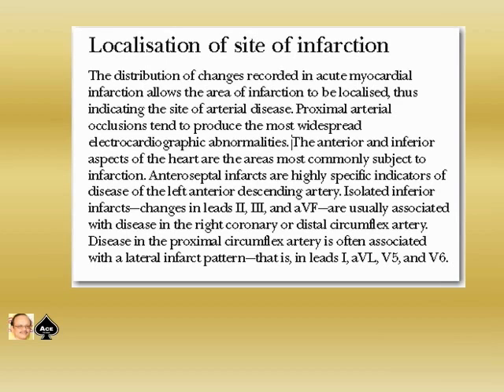Disease in the proximal circumflex artery is associated with the lateral infarct pattern, that is, leads 1, AVL, V5 and V6. Proximal circumflex artery, lateral wall infarction: leads 1, AVL, V5 and V6.